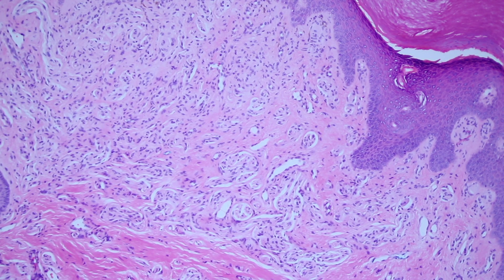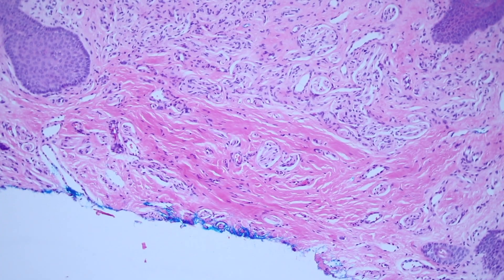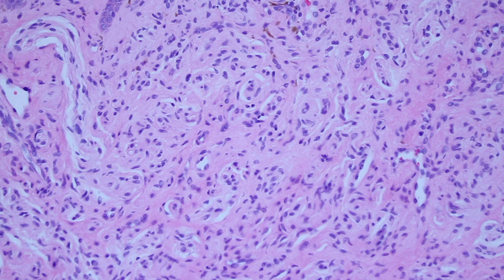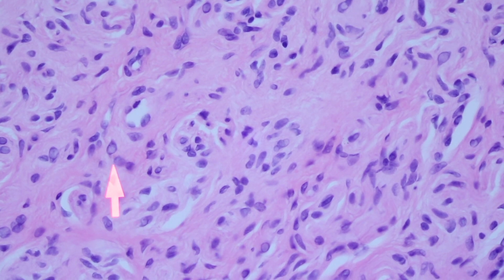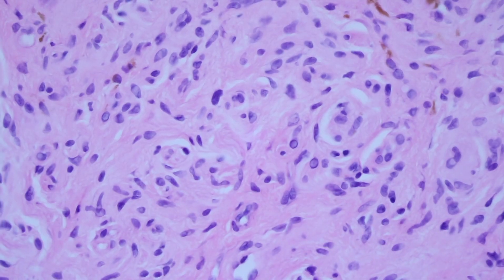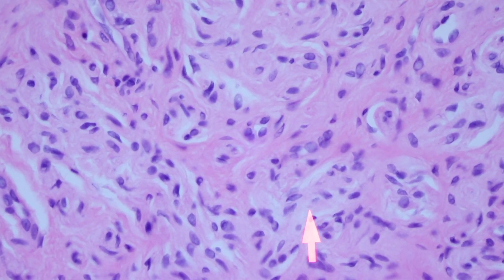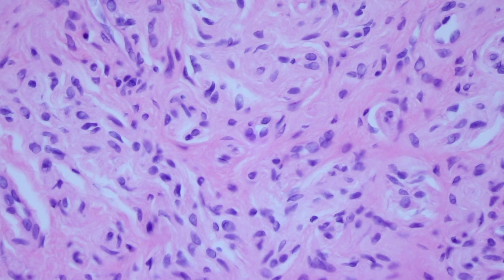Here they're bland little cells with a pale pink collagen background. The normal dermal collagen is that bright pink stuff, but the pink here is much more pale, like a light pink color. The cells are bland and spindled — some of them are kind of rounded on one end and pointed on the other end, kind of like a little sesame seed, like those little seeds you get on your buns at a burger place. Some people have compared them to sesame seeds.